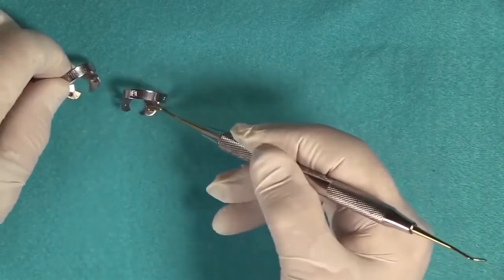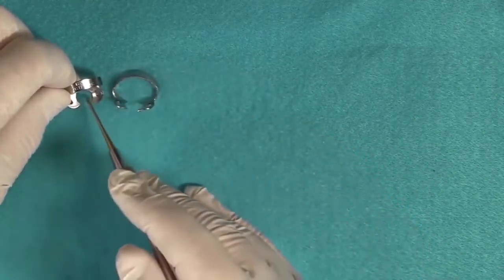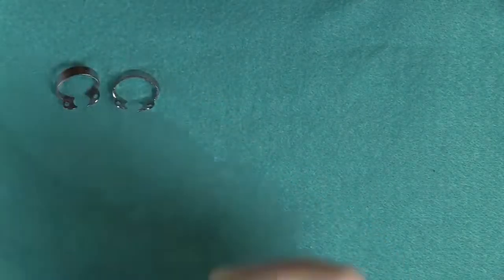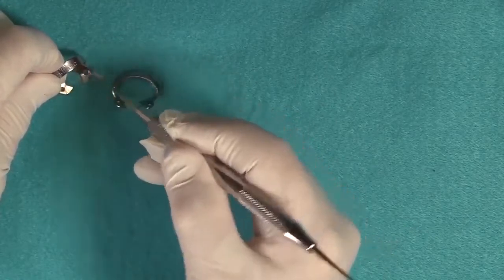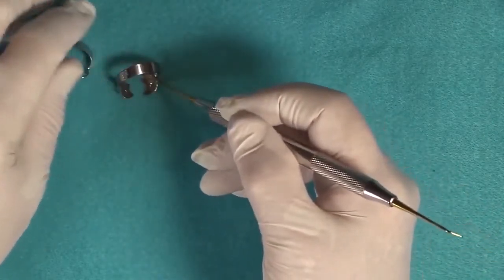You would look at this and say, oh wow, that's not for a molar. Yeah, it's like a premolar. But actually, where these engage is on the buccal and lingual surfaces. They don't engage totally in the proximal areas. The reason is because they're designed to retract the tissue in that area, because that's where you have your class 5. So these are uniquely designed for that purpose.